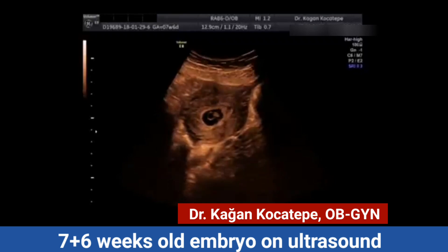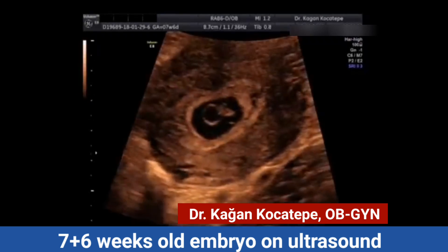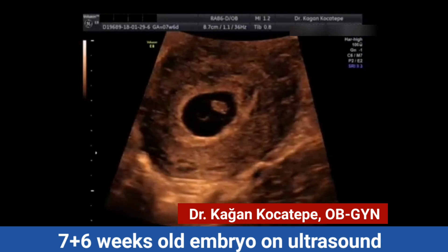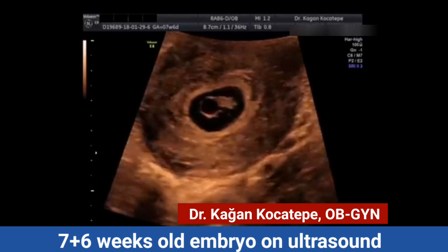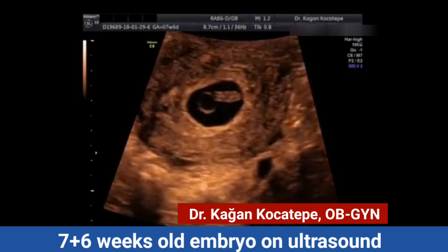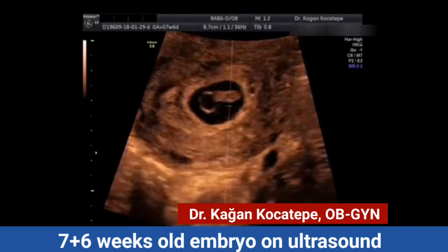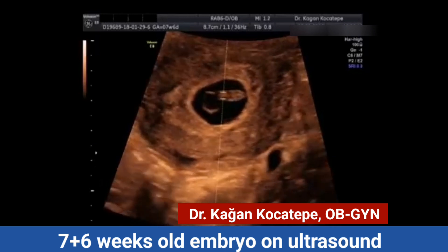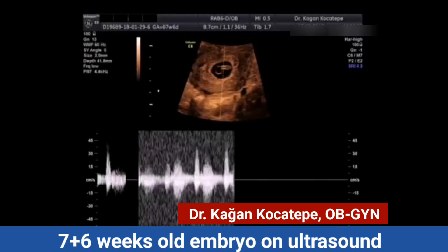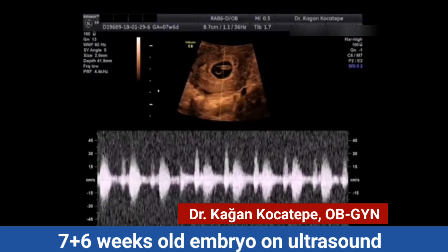Here we see an almost eight-weeks-old baby on abdominal ultrasound. We can clearly see the embryo and its heartbeats, as well as the yolk sac. Now we will measure the heartbeat.